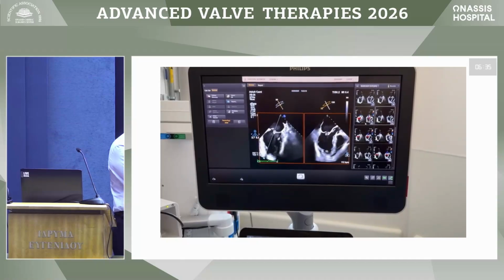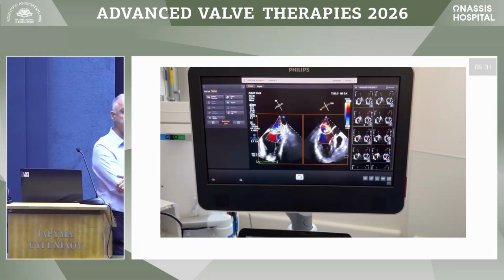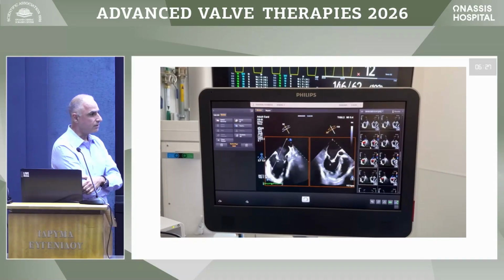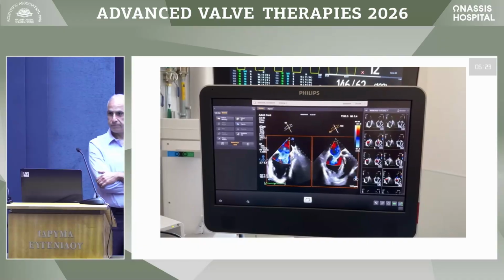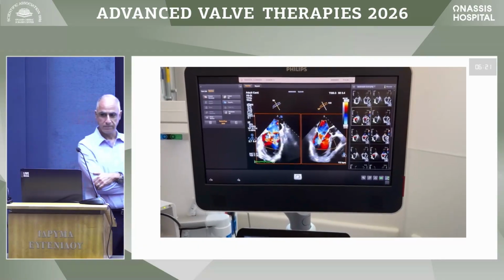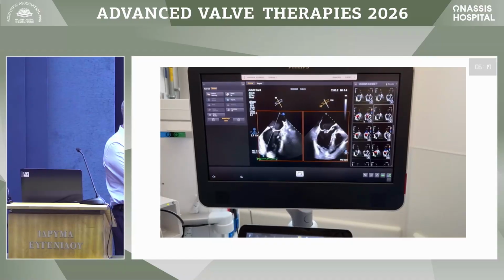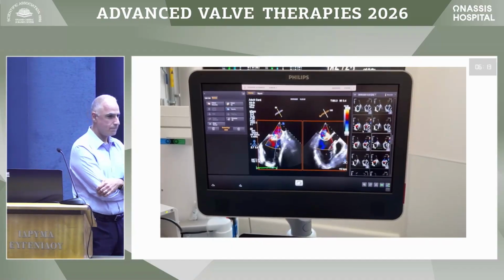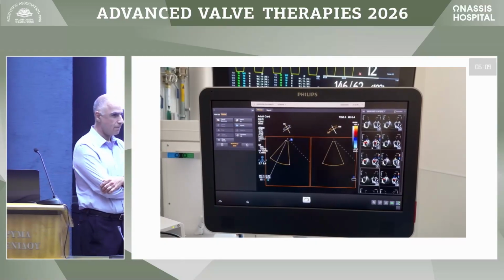So what would you do in this case? Any suggestion? I think because it's a fantastic case. We had that also, and it does indeed help in the acute constellation after the vessels are done to consider TEER. Okay. It's something that can be done if the patient is going in direction of cardiogenic shock and is unstable. It can be considered if the patient is not stable.